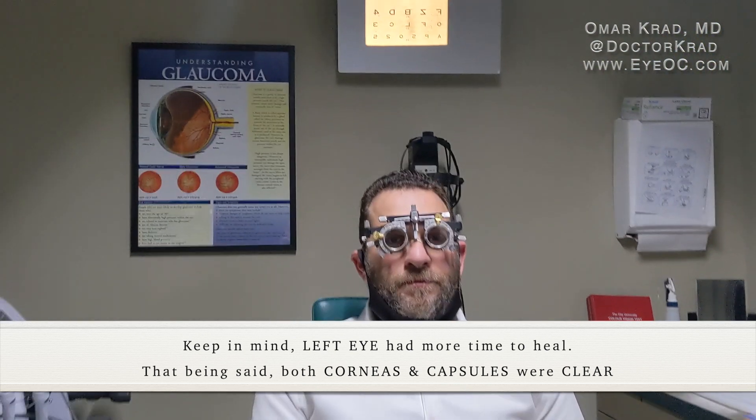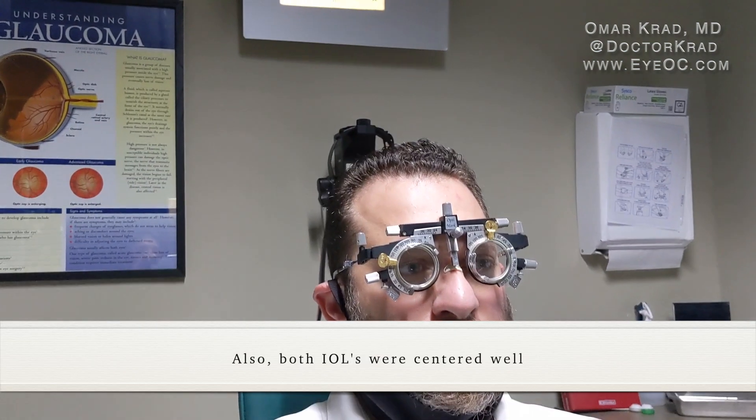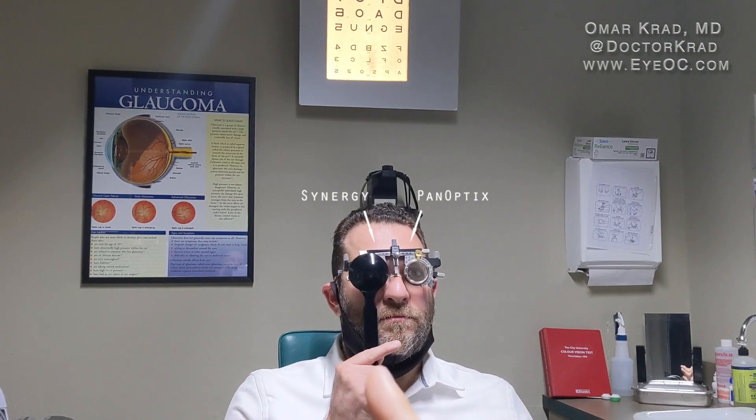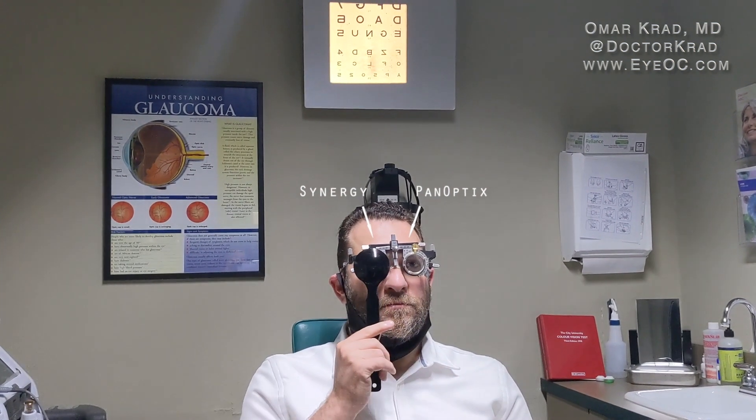First, in a bright room, we're going to compare the vision. Cover your left eye — there you go — now cover the right eye. Switch back and forth and tell me which eye you prefer for distance vision. Cover the left one. Do you like the Synergy distance more or the distance with the PanOptix?